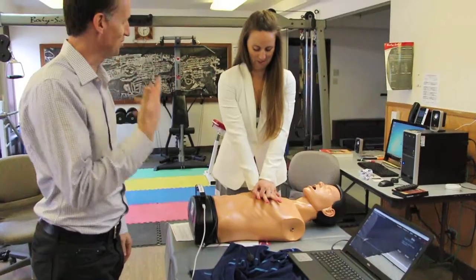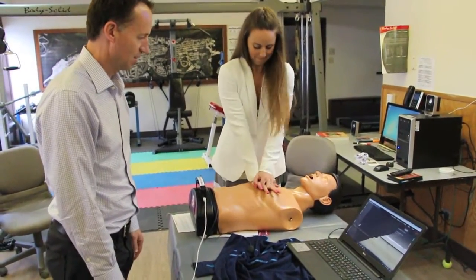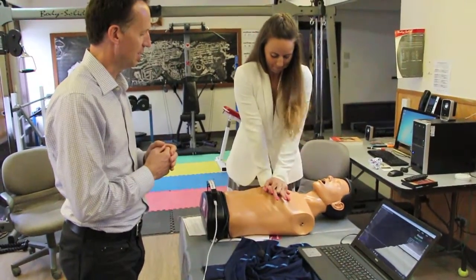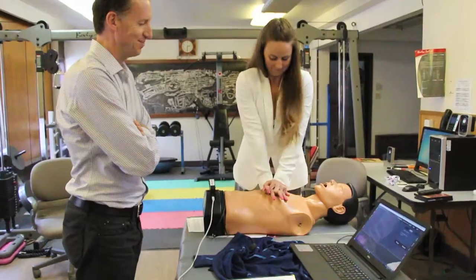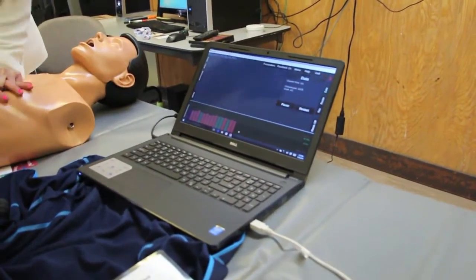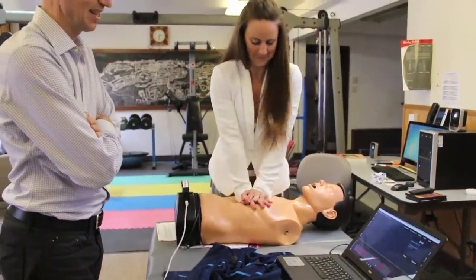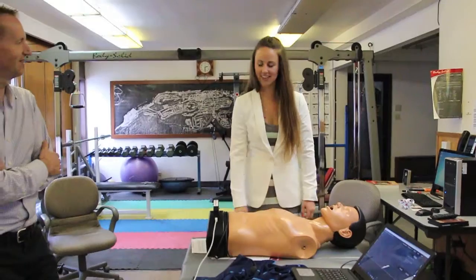Okay, that's the rhythm — ready, start pushing. Compressions, go! Good. That's a good rate, you're doing really well on the rate. Now push a little bit deeper. A little faster, a little faster — there you go, that's the speed right there. Keep going, keep going, keep going. Excellent! Okay, stop there.